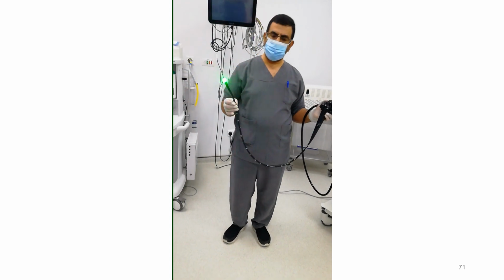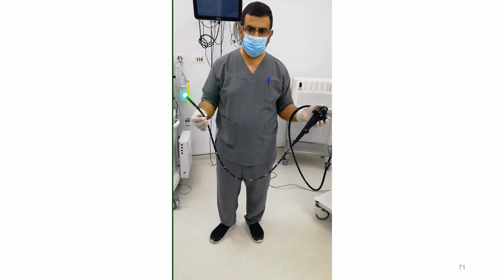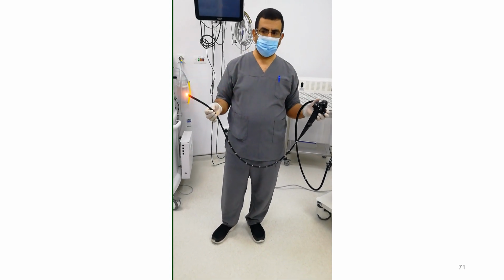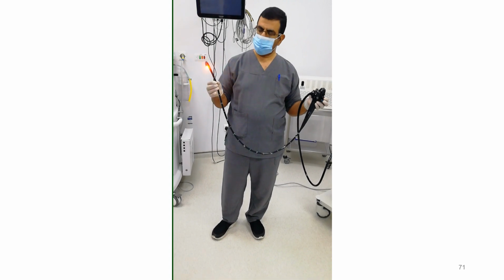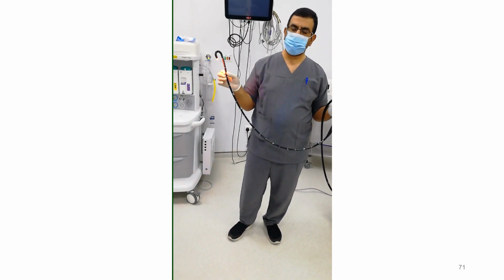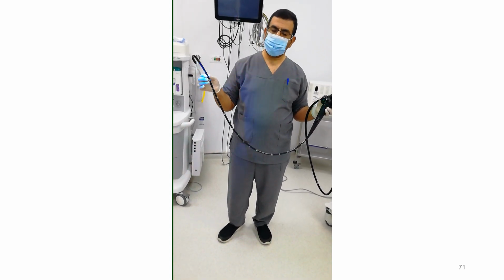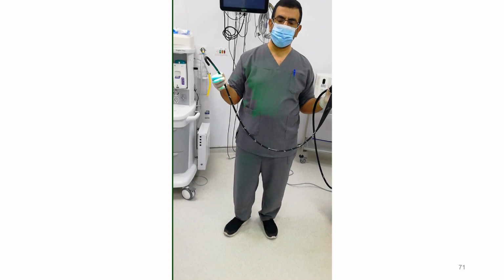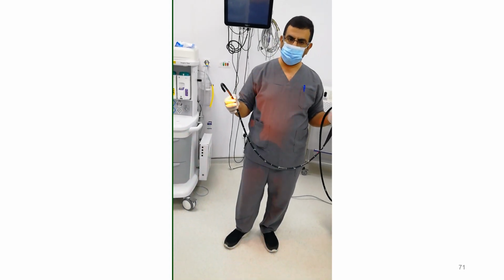من الحاجات المهمة جدا في حركات المنظار حاجة اسمها الريترو فليكشن. الريترو فليكشن يعني إيه؟ يعني إن أنا بجيب ماكسيمم آب فالمنظار بيلف على نفسه زي ما حضراتكم شايفين أهو، يعمل لك زي عصاية الهوكي، خلاص. فده ميزته إنك بتقلب المنظار وبتشوف حاجة مستخبية، لأن المنظار ده فورورد فيوينج زي الفندس أو زي السيكم أو زي الريكتم.